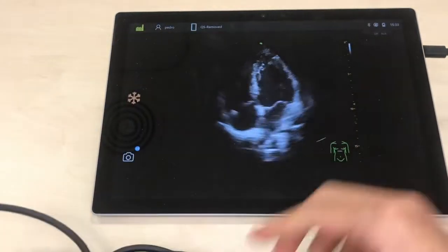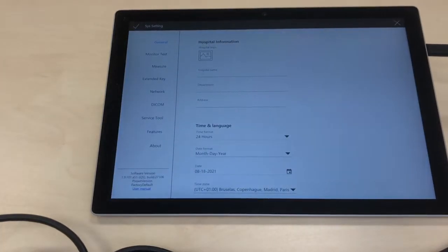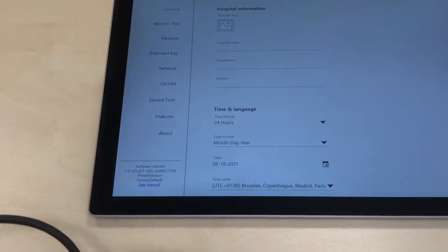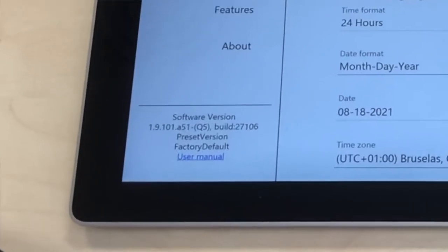The tablet is a Microsoft Surface with their software integrated. At the moment they don't allow use of the probe with any other tablet nor iPad Pro because of connectivity and image quality issues. Now let's see the software and its capabilities.